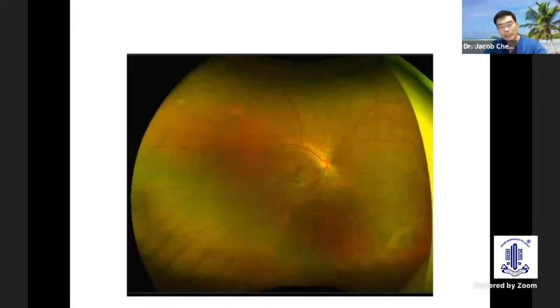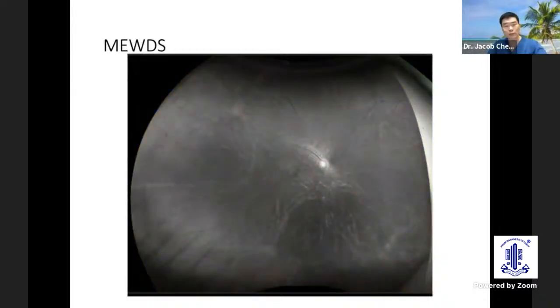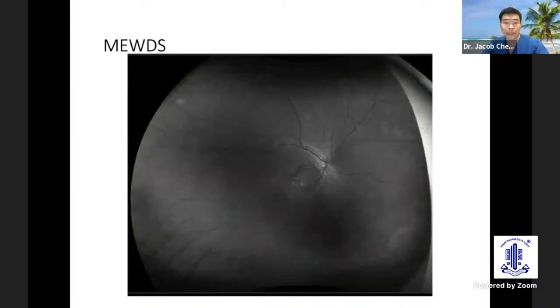This young girl presented with photopsia and blurring of vision. You can see all these whitish, yellowish dots in the posterior pole as well as in the periphery. The patient probably has MEWDS, or multiple evanescent white dot syndrome. We know that this is not a choroidal pathology. Using the red channel will not show any pathology, but the green channel highlights the retinal pathology, and you can see the white dots are actually accentuated.